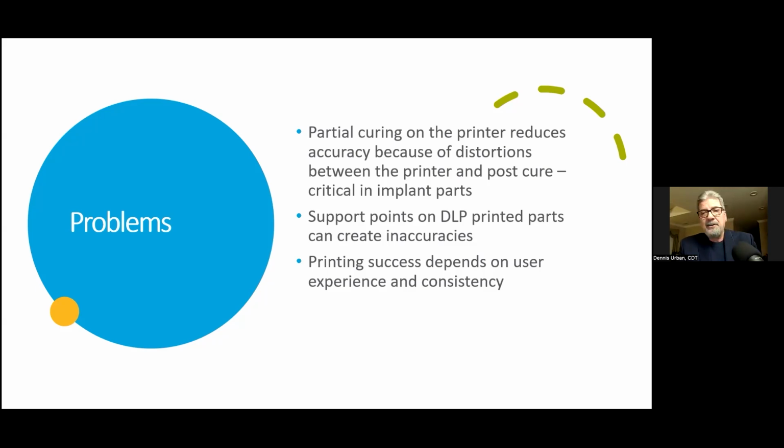So be careful how you hold those dentures, especially on a lower. Those support points on the printed parts can create inaccuracies. You want to make sure the support points are in the right place when you're nesting your dentures. So printing success depends on the experience and consistency of the user.